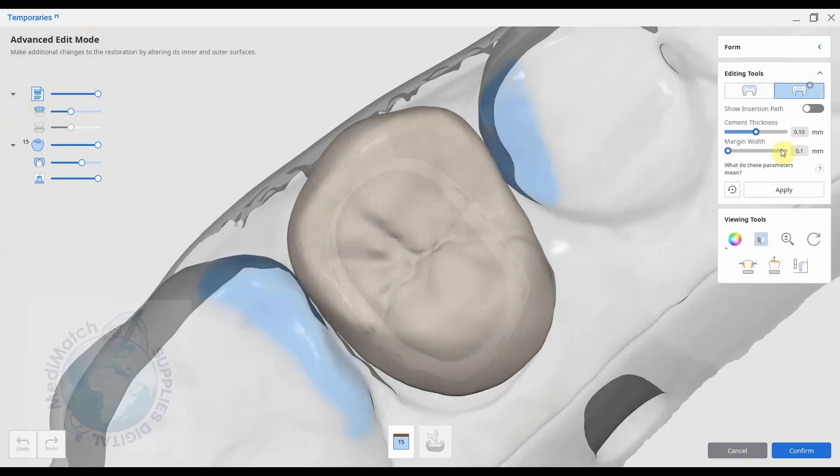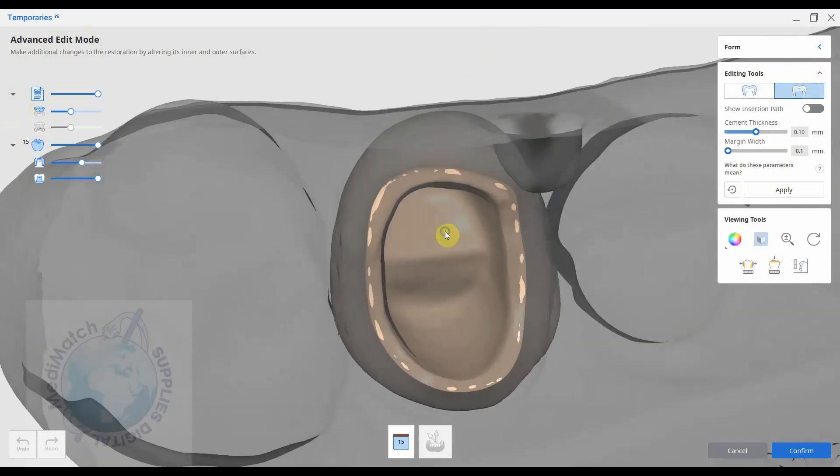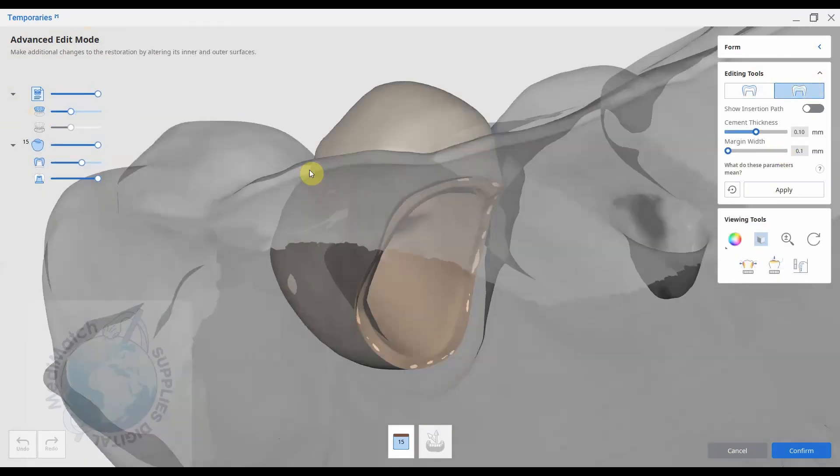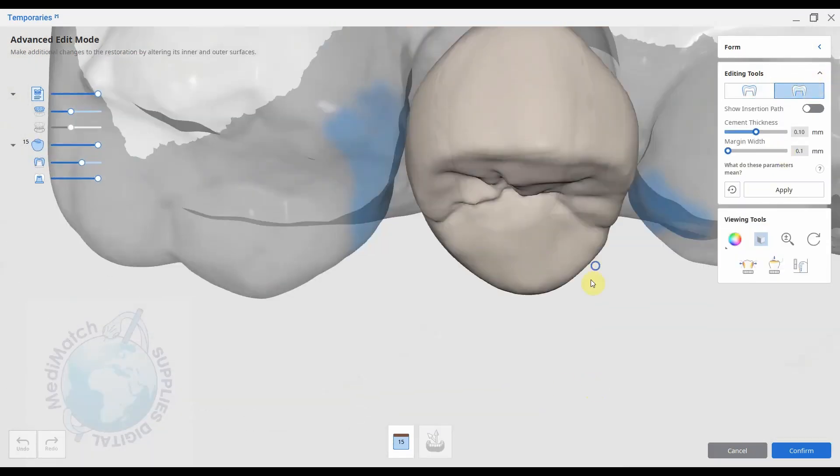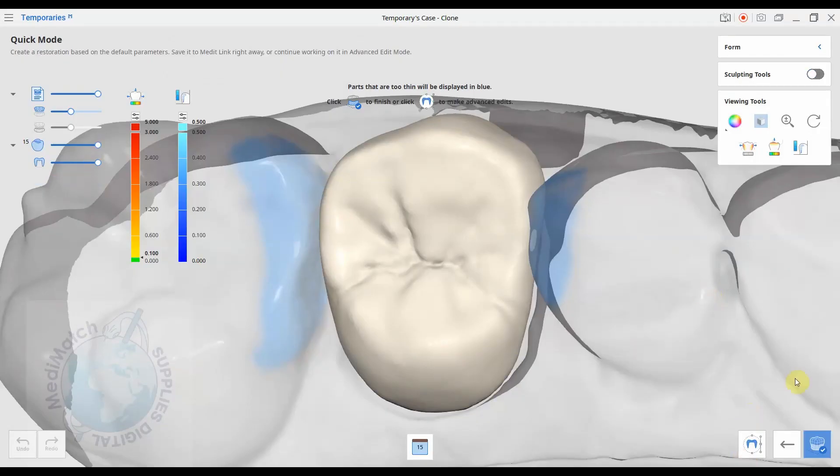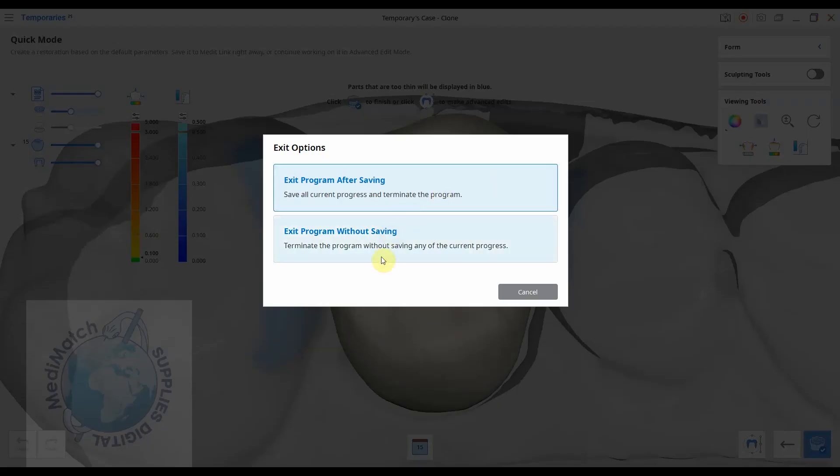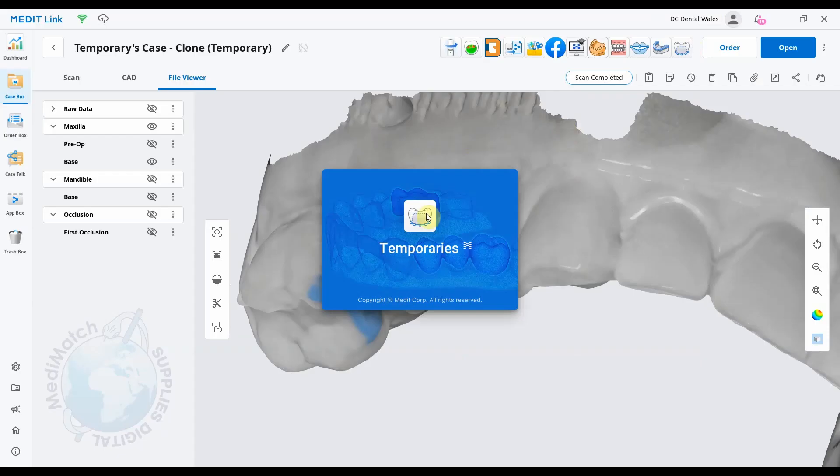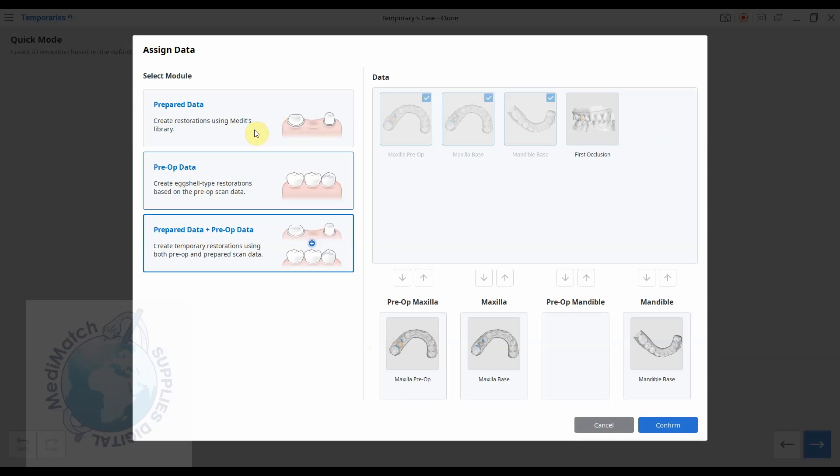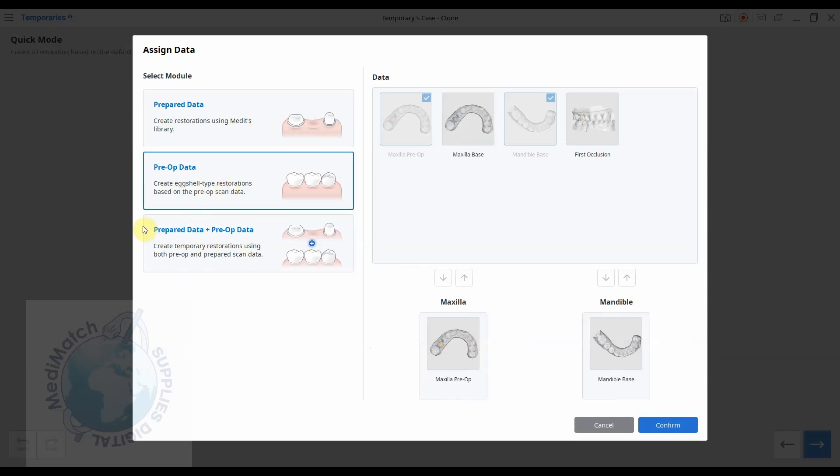By clicking on the advanced edit, you can work on the outside or the inside surface. Okay, so let's exit that and let's try one of the other modes then.